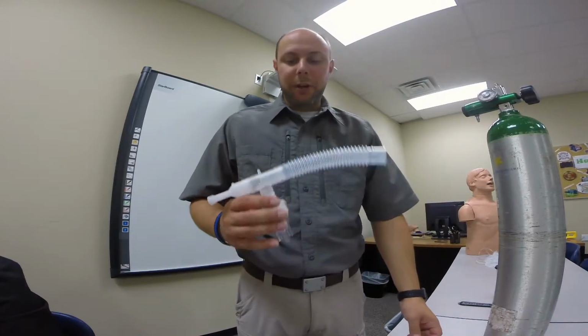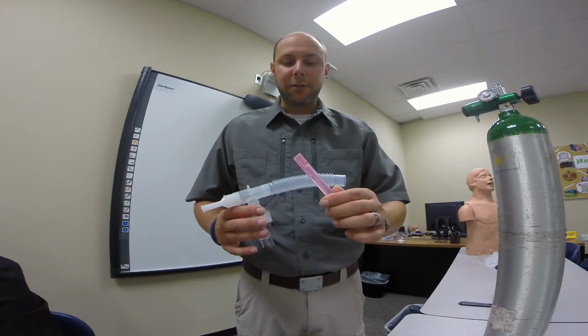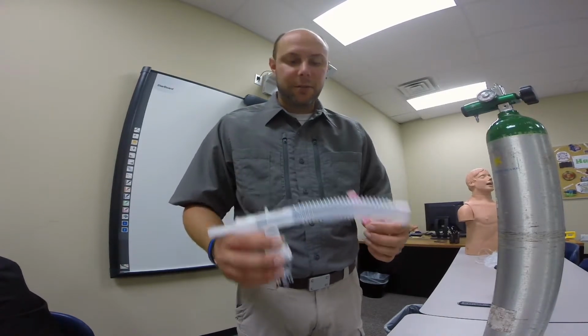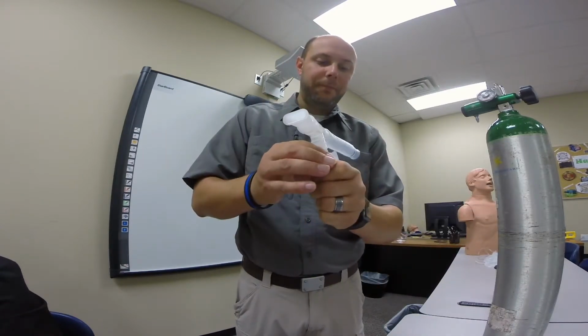So in this case, we are going to administer a neb, but I'm using normal saline instead of a medication so that you can actually see it vaporize. So you want to unscrew the reservoir.